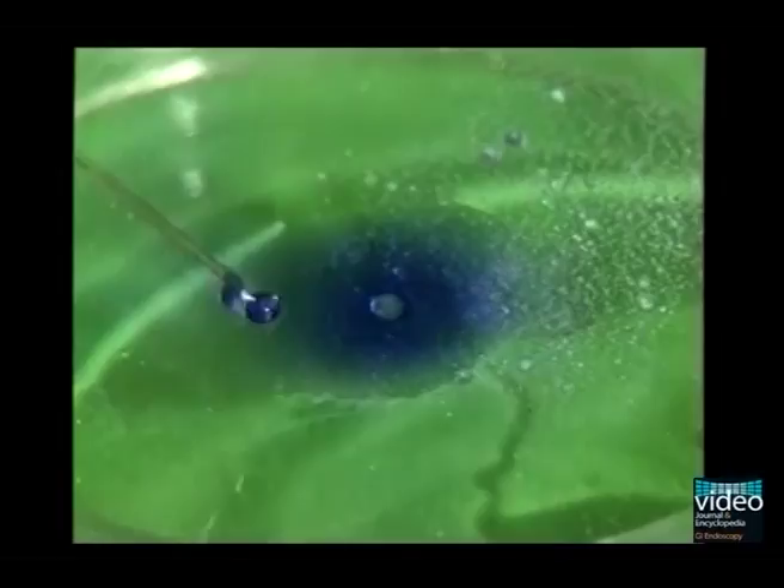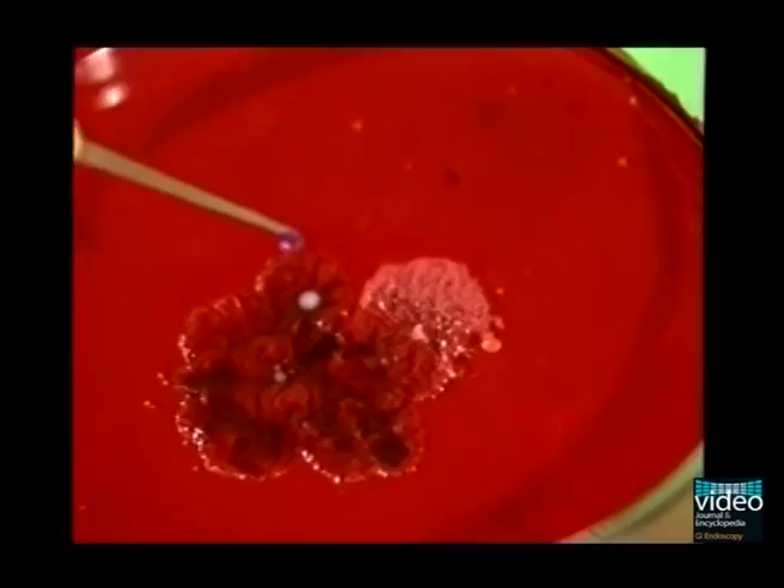Here we show basic characteristics of the glue. You see that cyanoacrylate glue is well water-soluble. In contrast, when the glue comes in contact with blood, immediate polymerization and hardening occurs.